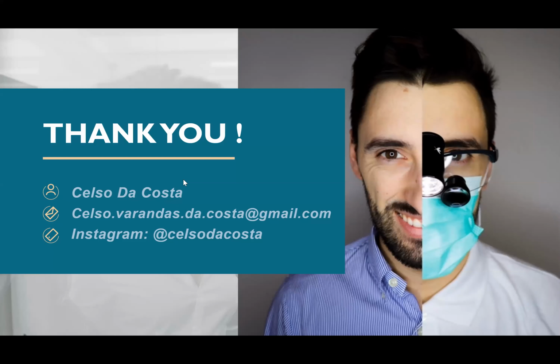Excellent. Best advice to manage patients with sensitivity after Blank One Click treatments? Do you have sensitivity? I never had sensitivity with Blank One Click. Honestly, if you have it, I think it's the universal system. Do some fluoride after the whitening. I do it every time after whitening. Provide sensitive toothpaste, and a fluoride varnish once a week at home. But to be honest, I never had any sensitivity due to Blank One Click, so it's unknown terrain for me.